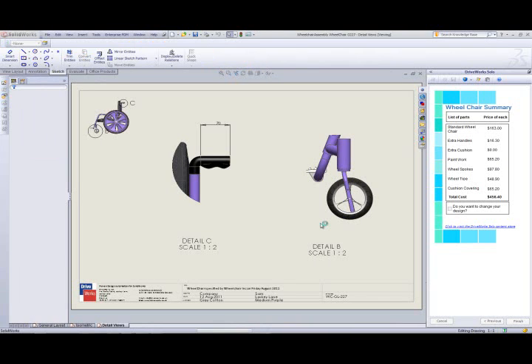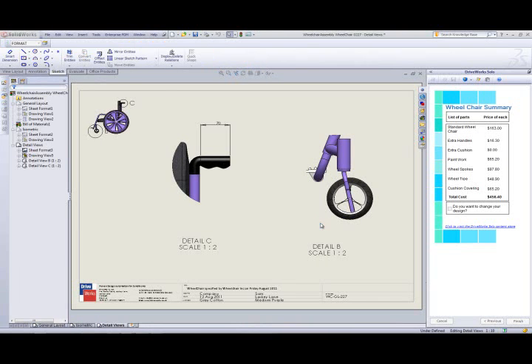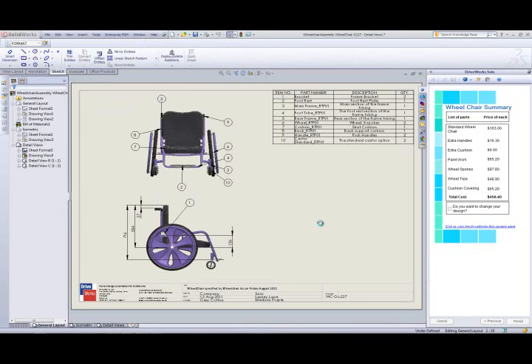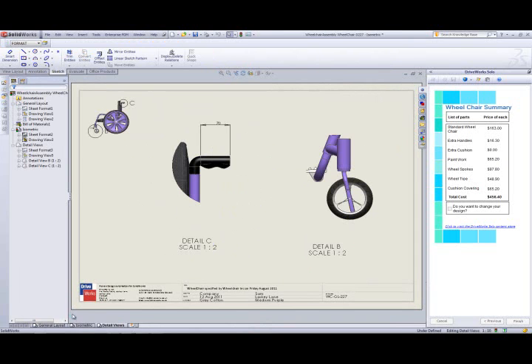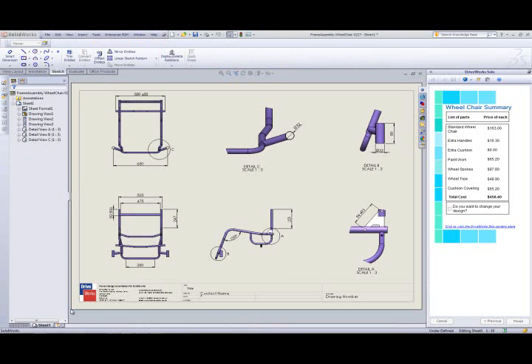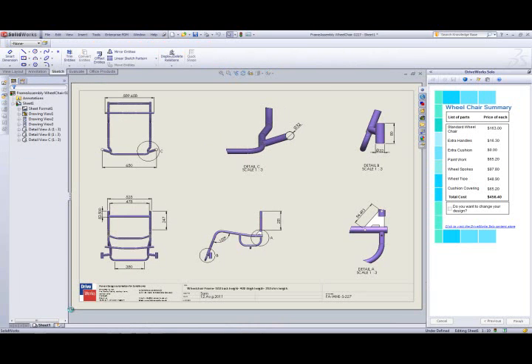Once the model is complete, DriveWorks Solo will finalize the drawings, rescaling and resizing them into the correct position, and then finally, Windows Explorer will display so that we can open and review the outputs created.